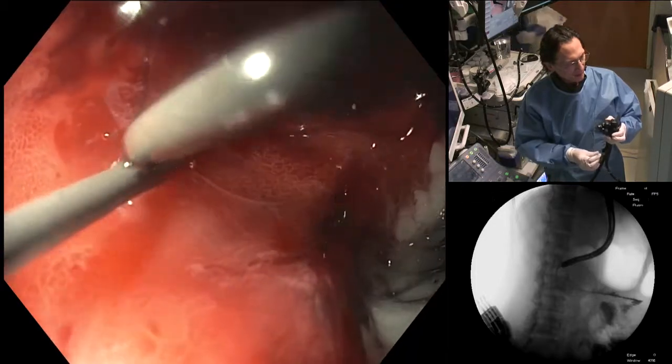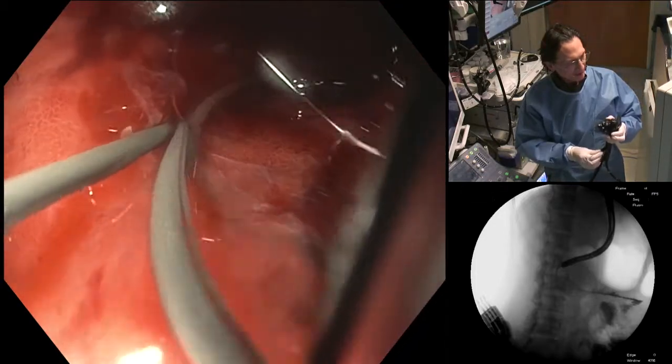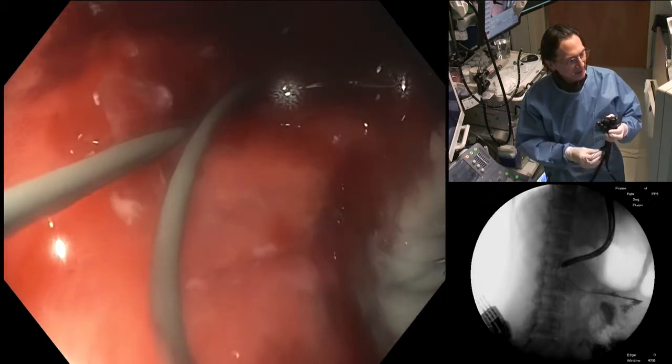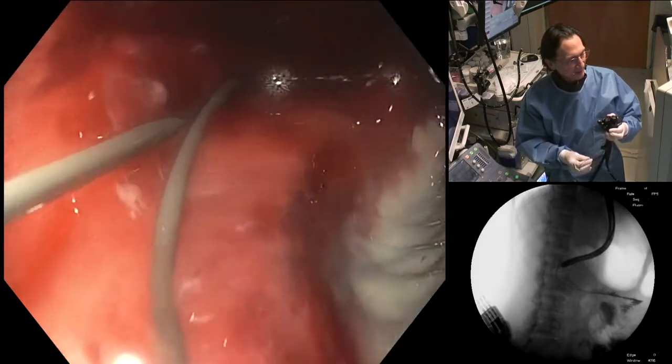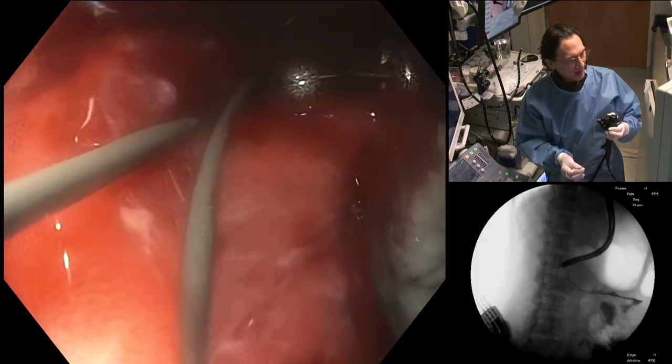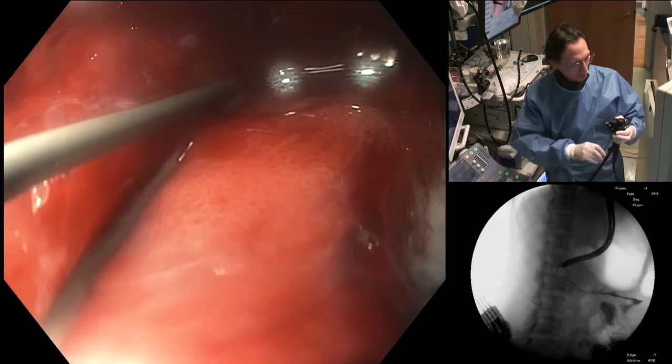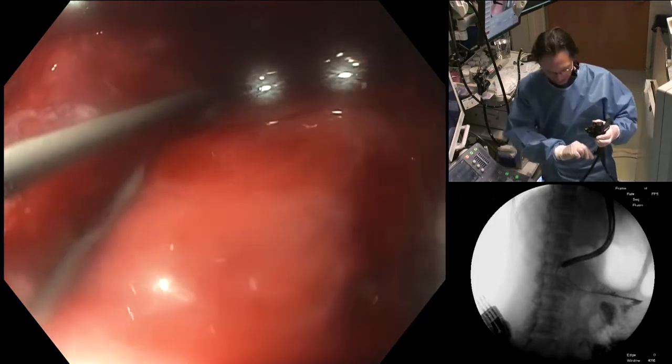You can push faster, Jeannie. Please keep pushing. And as long as you see that second coil where it came back on itself, we're good, because that'll start coming back first. All right, good. I'm going to hold the wire. And now, please.